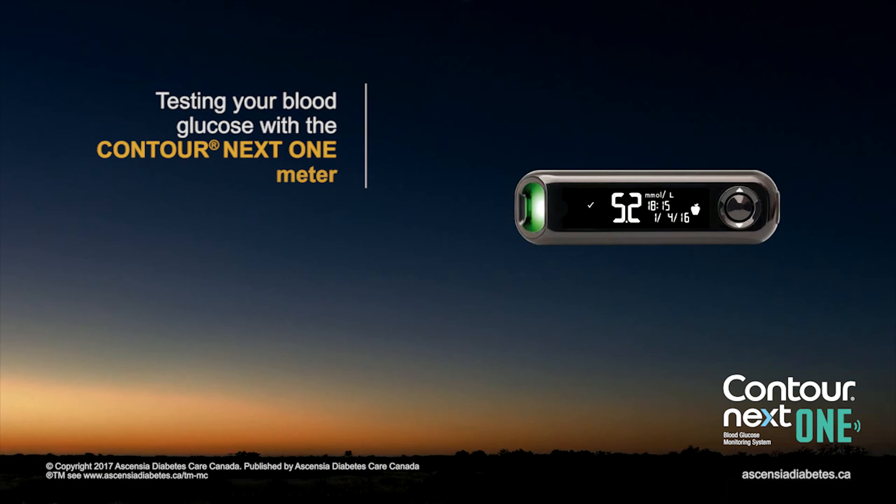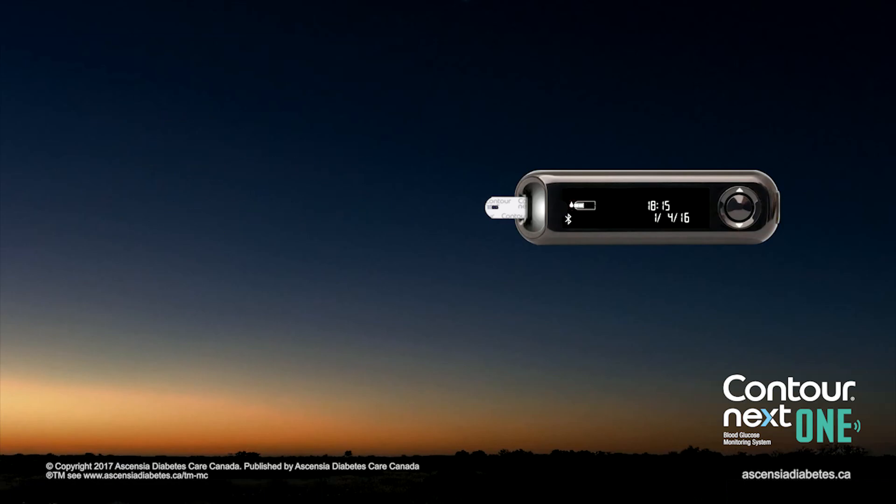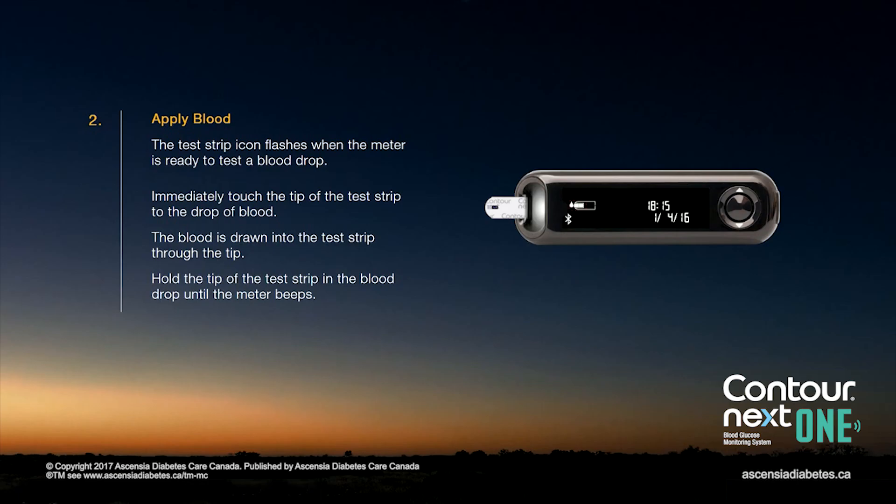Testing your blood glucose with the Contour Next One meter. Hold the test strip with the grey square end facing toward the meter. Insert the grey square end firmly into the test strip port until the meter beeps. The test strip icon flashes when the meter is ready to test a blood drop.